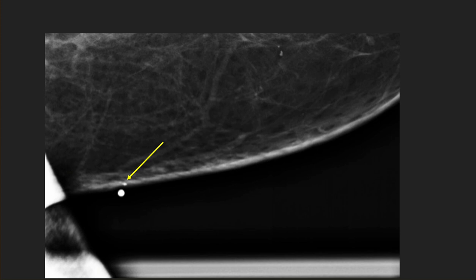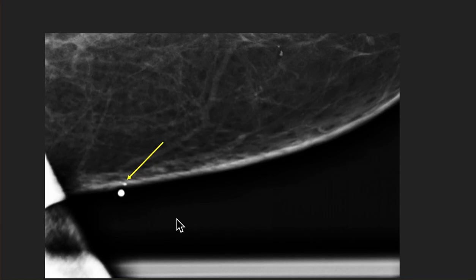Just a couple of examples of ones that were confirmed skin calcs. You can see the calcs right within the dermis, the BB is over it — this is just the tangential view confirming skin location.